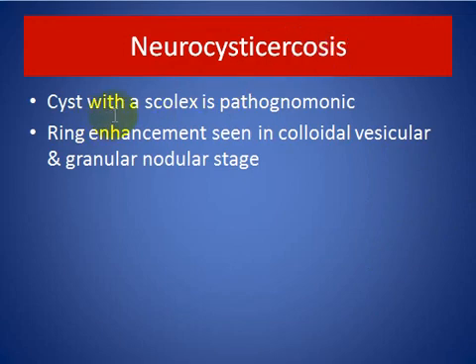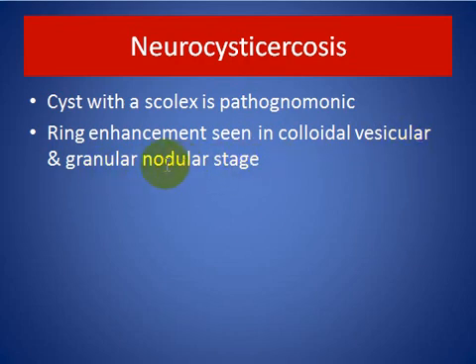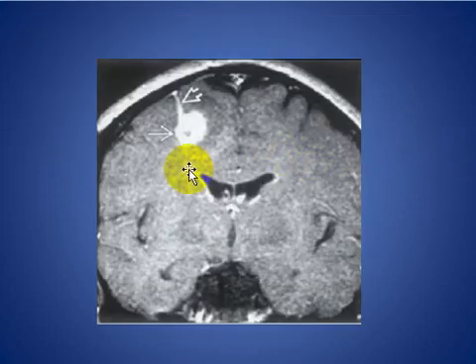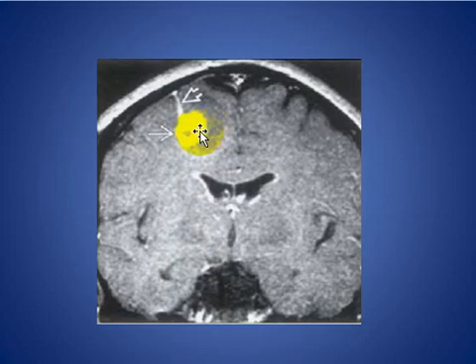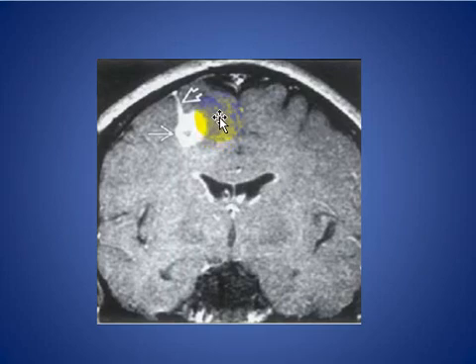In neurocysticercosis, a cyst with a scolex is pathognomonic. Ring enhancement is seen in the colloidal vesicular and granular nodular stages. Here on this coronal MRI image, a leptomeningeal enhancing area appears to extend to the brain surface with a solitary neurocysticercosis cyst, showing associated inflammatory changes at the surface.